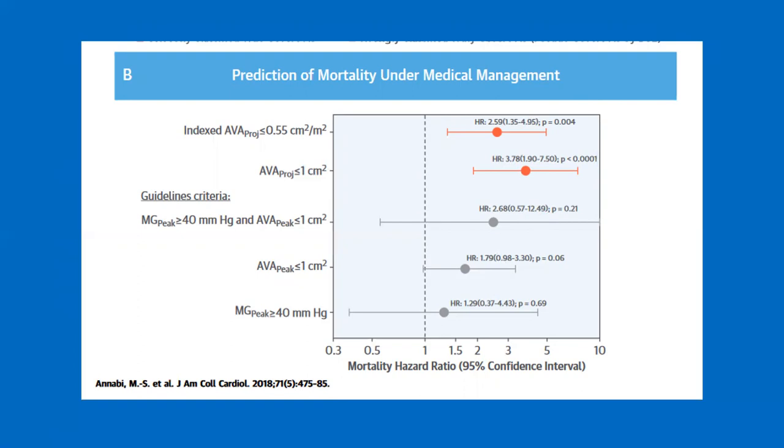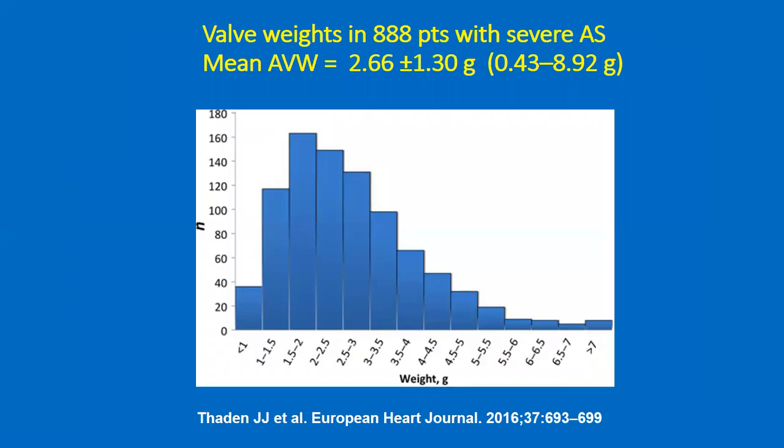So keep in mind that projected aortic valve area is worthwhile to measure, even though it takes a little more time, and has great prognostic value.